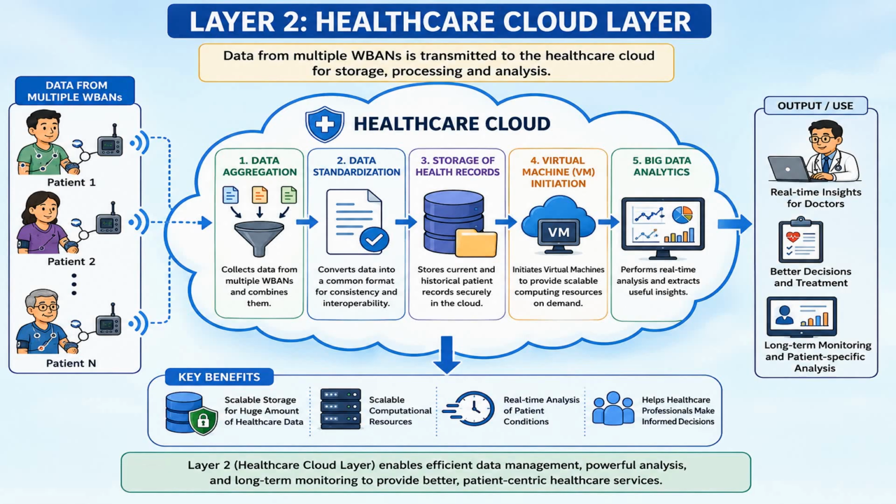The cloud processes the large data sets and generates meaningful insights about the patient's health, and real-time analysis enables the early detection of health abnormalities and supports timely medical intervention. So here you can see how the doctors and healthcare professionals use the analyzed information. The cloud provides real-time insights, supports better diagnosis and treatment decisions, and enables long-term patient-specific analysis.